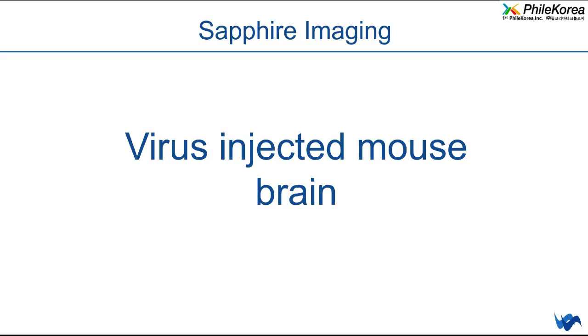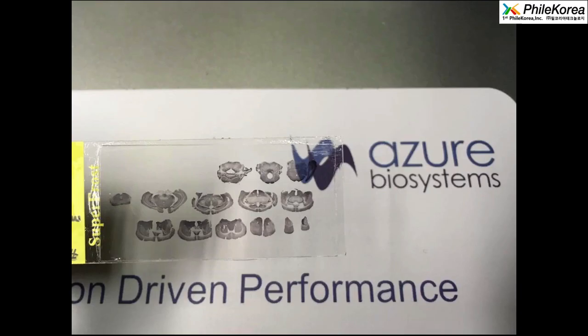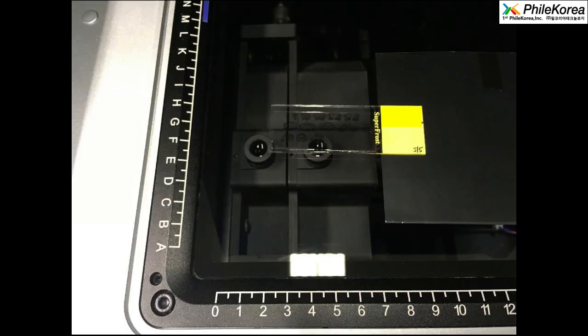We have also done an experiment with a virus-injected mouse brain to localize the hippocampus. So you see the original microscopic slide. We put it on our scanner and scanned it. And here are the results.